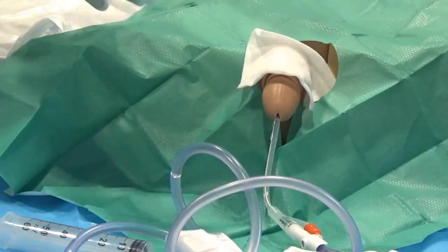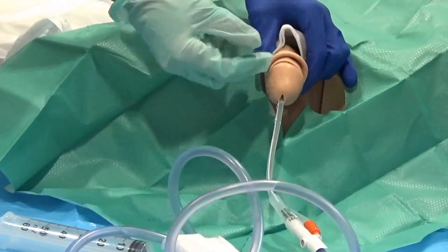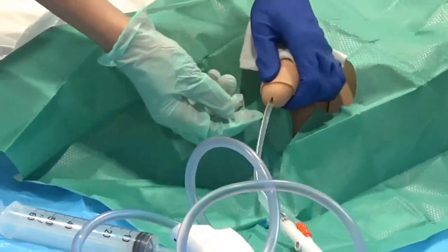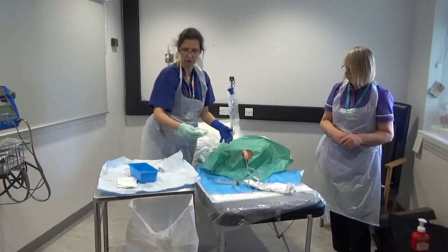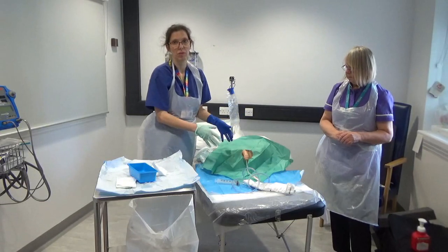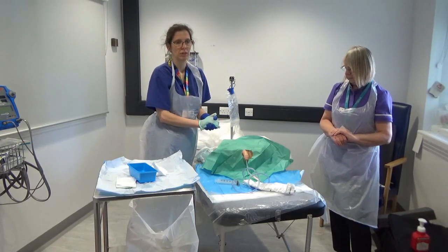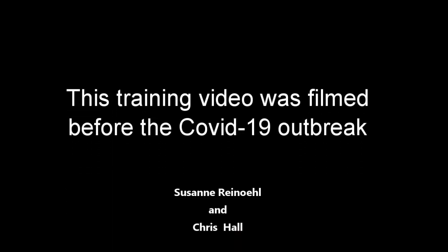Now the most important thing to remember is the foreskin — retract it back into place. Otherwise it causes a constriction and you can give the patient a completely avoidable paraphimosis. On the patient, just slide the foreskin forwards. Clean nicely around with a gauze, removing any extra gel. That's the catheter inserted. All that remains now is to clean up around the patient, make sure the bed is nice and dry, reposition the patient to a more comfortable position, attach the strap around the thigh to prevent friction or traction injuries from the catheter, and then go away and document what you've done in the notes.